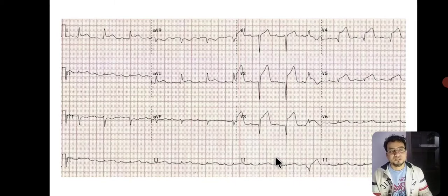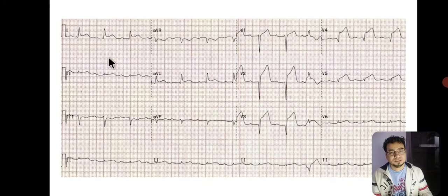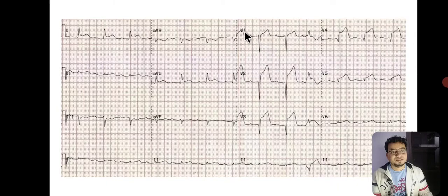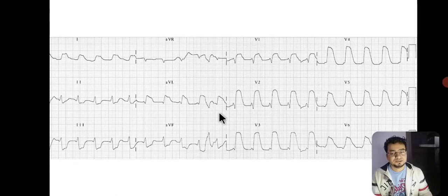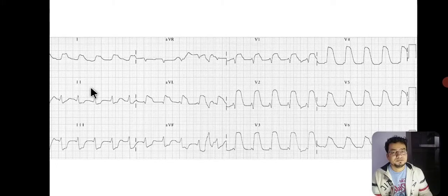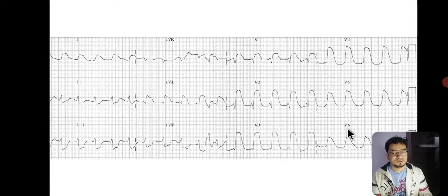Now look at this ECG — look for ST segment elevation in lead 1, lead AVL (lateral leads), and also in the precordial leads V1 through V6. There are ST elevations in multiple leads, suggestive of acute MI in the anterolateral wall of the left ventricle.